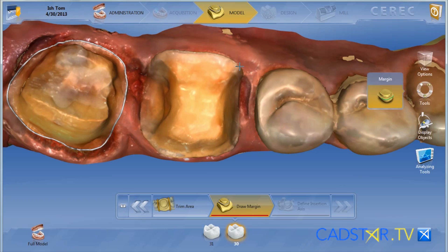For Omnicam users, this is where it sizzles. It will scan faster, and it will scan what we call shiny surfaces very well — that's Emax, titanium, and gold. Margin clarity is exceptional. At last, to me, the Omnicam has fully moved past BlueCam in all aspects of your image, including knife-edge margins. They are easy to capture, easy to use, and automatic when your margin is high and dry.